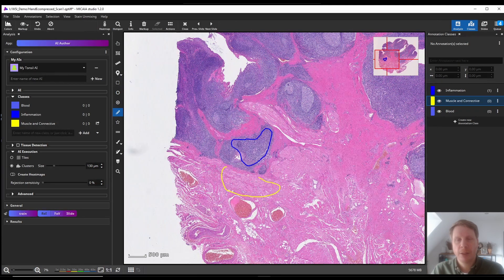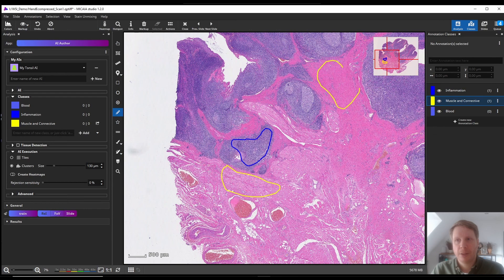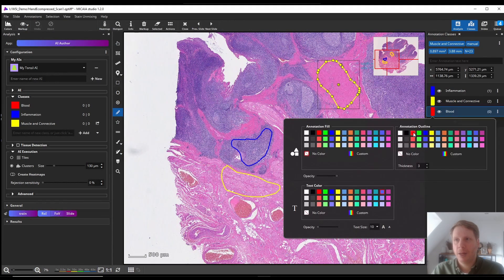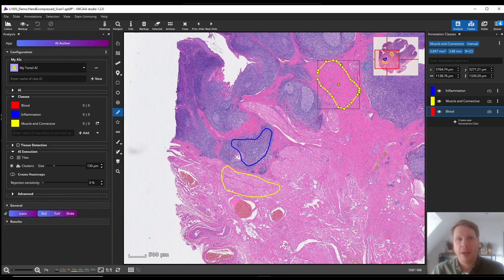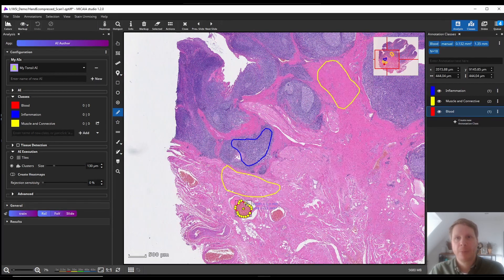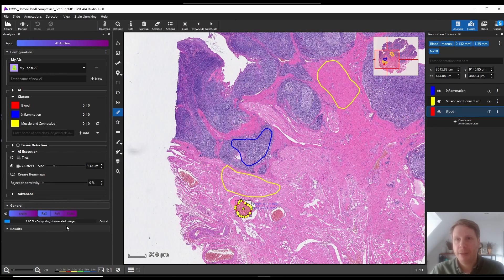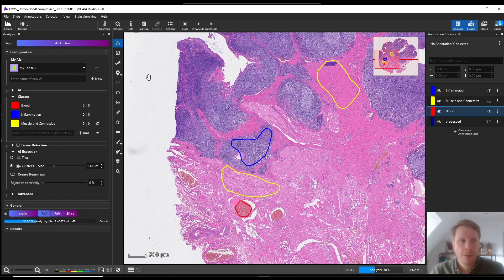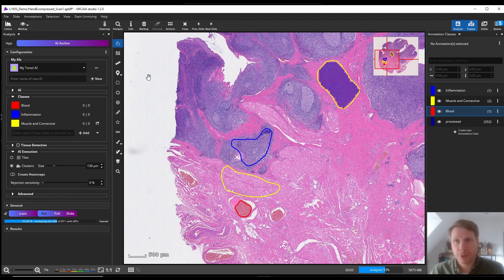The annotations don't really have to be very accurate, but what's important is that the tissue they contain really is 100% only that class. I can add multiple annotations for every class. It's important that I train the AI on all the different appearances that this tissue type can have. Now I click Train and you can see how patch by patch the AI analyzes these regions and tries to figure out what makes them distinct.